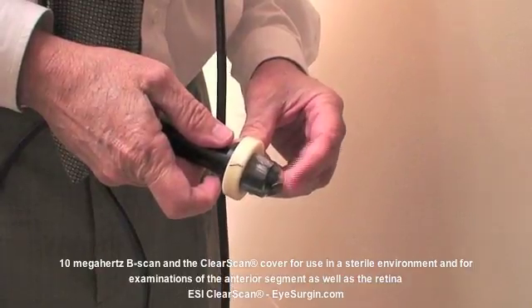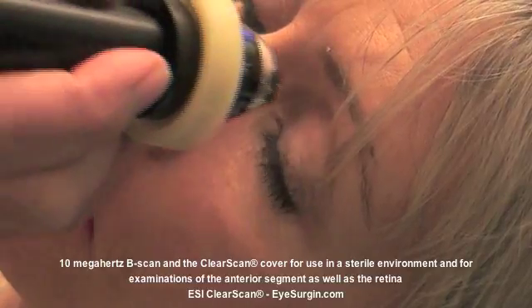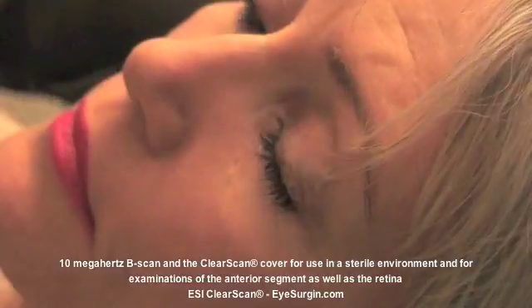In other words, the gel acts as an interface between the probe and the inner bag surface. Also place gel, such as Genteal, on the outer surface of the bag, and you're ready to begin your ultrasound examination.